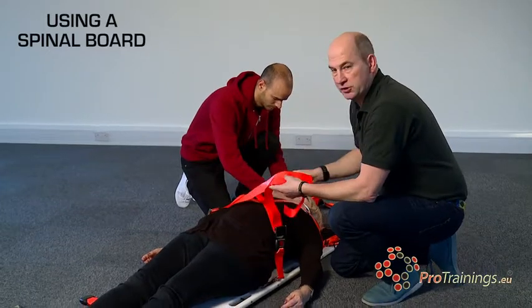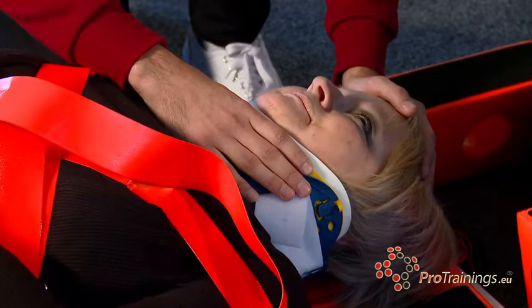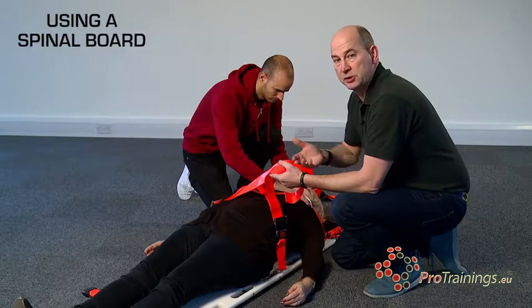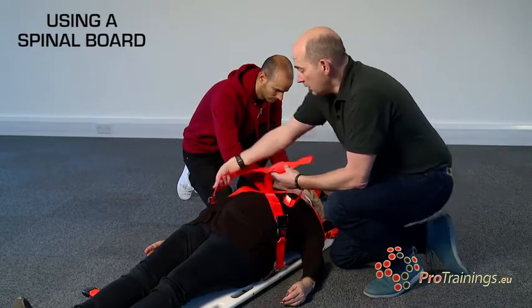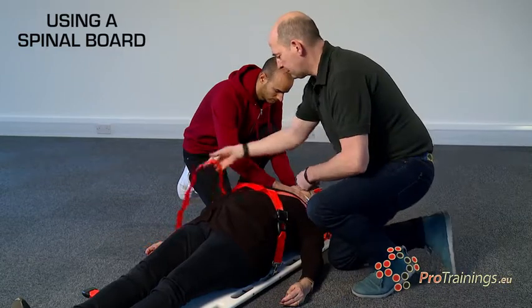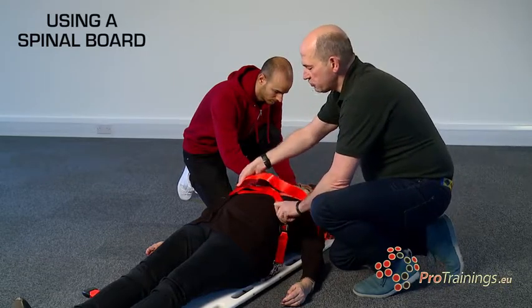It's important at this point to get the patient to take a deep breath in. If we don't, when we pull the straps up we restrict the breathing. If the patient takes a deep breath in and then breathes out, it allows enough movement for comfortable breathing. So take a deep breath in, then we adjust the straps up tight — breathe out — and we've now allowed enough slack for the patient to breathe.